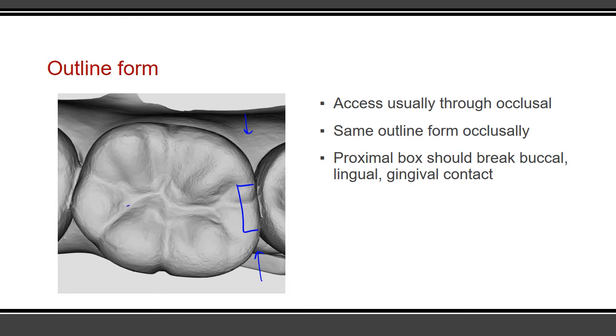So we're going to have our class 1 prep normally, but then you're going to drop a box in the proximal. And you should break buccal, lingual, and gingival contact. And we'll see what that means in the next slide.